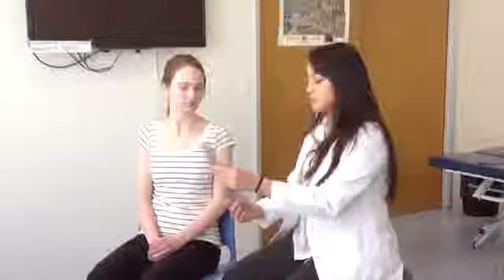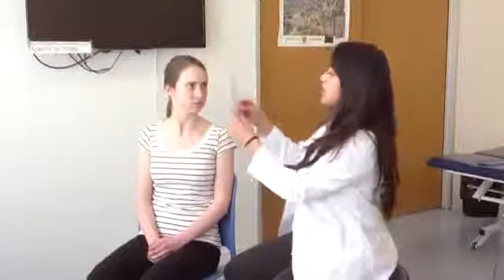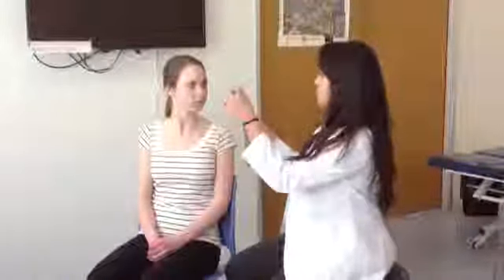All right. How are you doing? I'm good, how are you? I'm good. So today we're going to be measuring your cervical extension. So basically how far you can tilt your head back. Okay. And we just want to do this to make sure that you can go through the normal range of motion. All right, so we're going to be using this tool. It's called a goniometer. We have this arm here that's stationary, so it's just going to kind of go up against your head and stay put while this arm will move with your motions. Okay. But before I do that, I want to make sure you're sitting nice and tall in the chair.